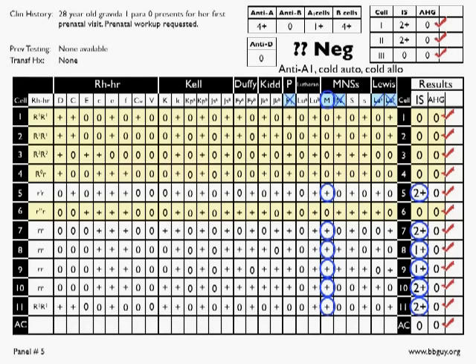If you're in the real world, honestly, 99.9% of immunohematologists, I think, would say you've got to do all the rule outs. You've got to do all the cross outs and go through and do all these things and see what you have and see what you don't have. And again, it's pretty clear in this case that this is an anti-M. So I'm not going to take you through each and every one.